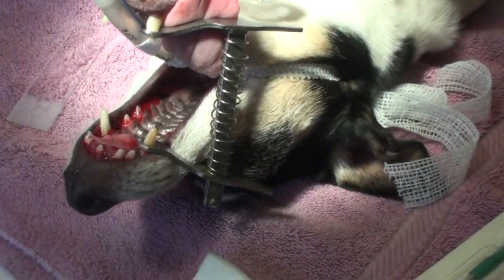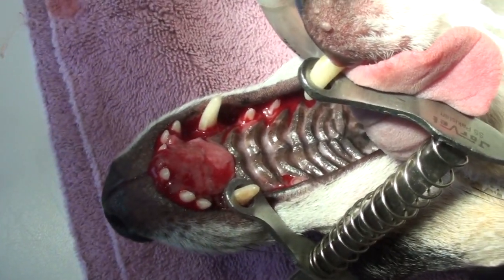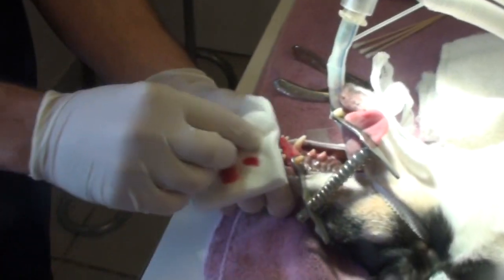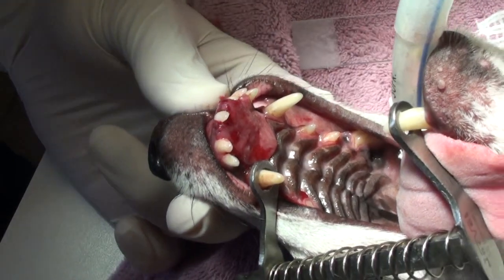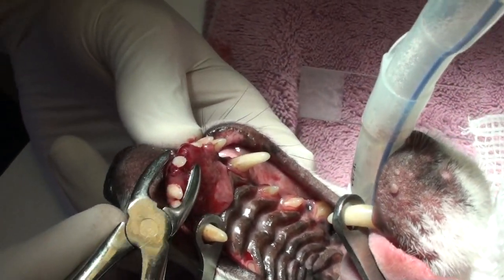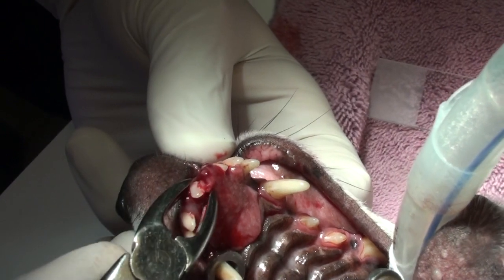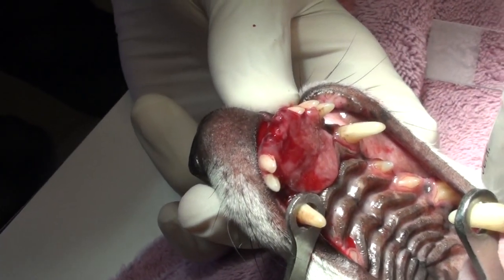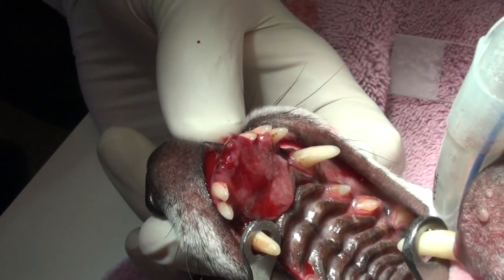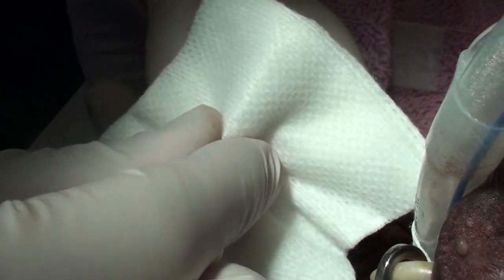You can see the mass that we're going to biopsy right there on the roof of the mouth. The tumor has actually grown around the teeth, and the teeth are loose — easily pulled out. That's the whole root. And then we're going to take a little piece of the tumor and see if we can identify what it is.